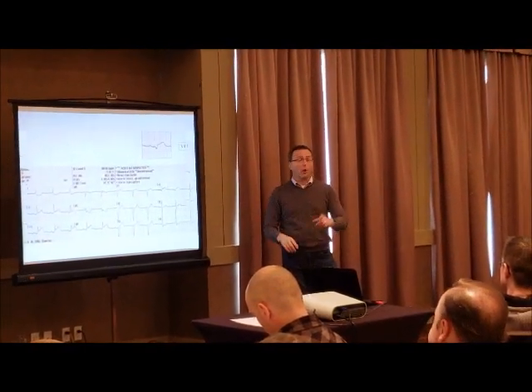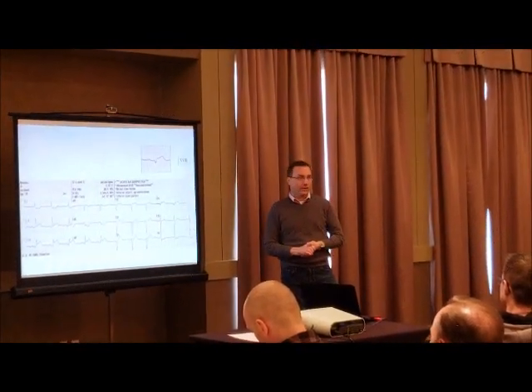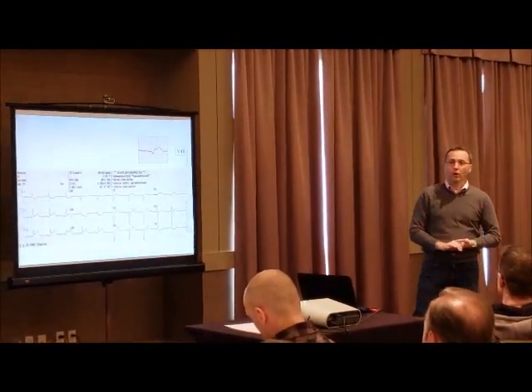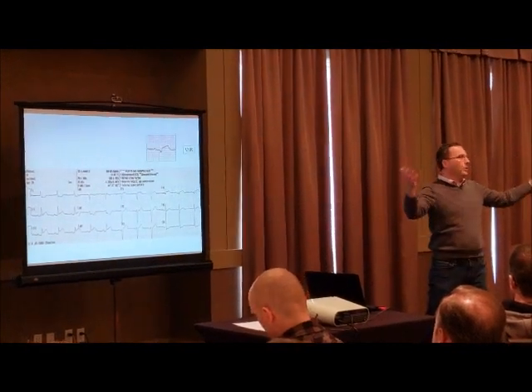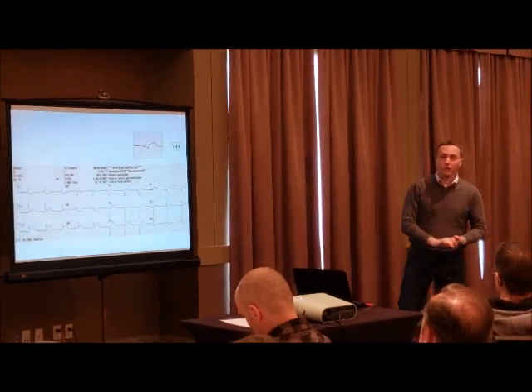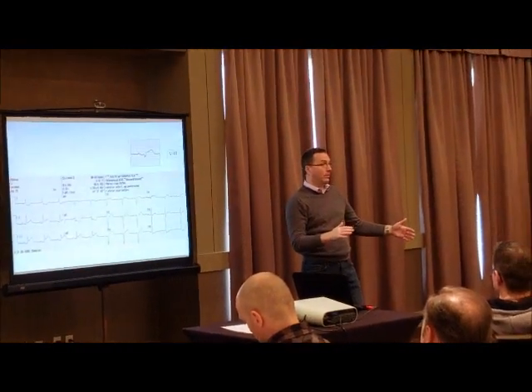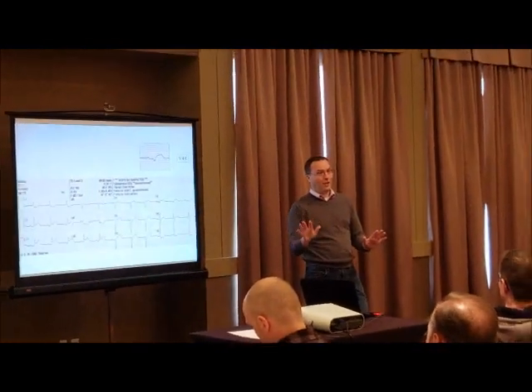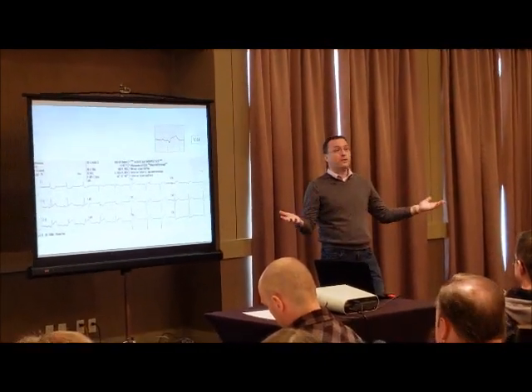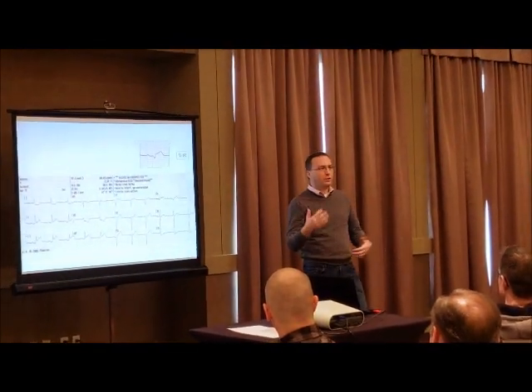We're gonna start an IV and do a preemptive fluid bolus and then do a trial dose of nitroglycerin. This is what we decided, okay? So we started an ECG. We started an IV, we gave her a fluid bolus. It brings her pressure up to like, I don't know, 120/70, something like that. It gives us a little more room to play. And we did a trial dose of nitroglycerin, which brought her pressure all the way back down to like 98/60 or something like that. And I'm like, okay, I'm stopping right there. I don't like what happened with my little trial dose of nitroglycerin. That's playing it a little too close right there. Whether I should have done that or not, I still wonder about to this day. Like, should we be messing with nitroglycerin at all if there's a possibility?